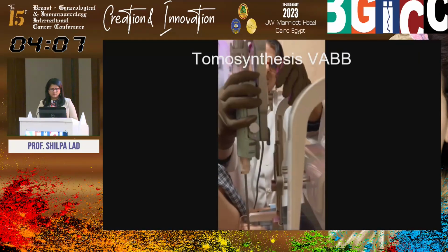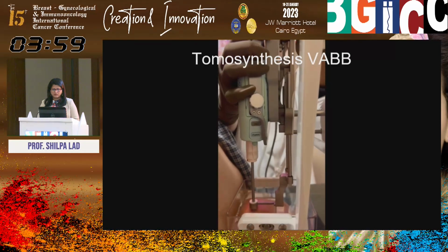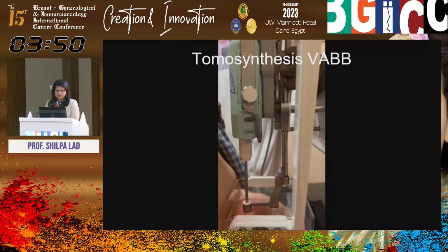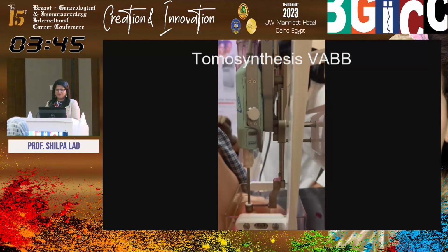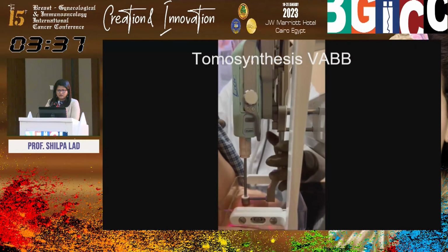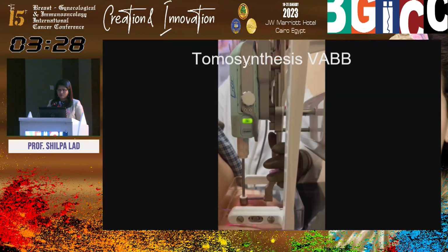I need somebody with me. Okay, so we're almost there. We're almost there. We're going to mount this up here. Are you okay? Are you perceiving any pain? No, I'm feeling very hot. Hot? Okay. This is only going to take about a minute. Are you dizzy? No, I'm okay. You okay? This will take only about a minute. So you may feel a little bit of a vibration, but that's about it. You shouldn't feel any pain. Okay. So let me know how you're feeling right now. Are you all right? Yeah. Okay, great. Excellent. You're doing very well.